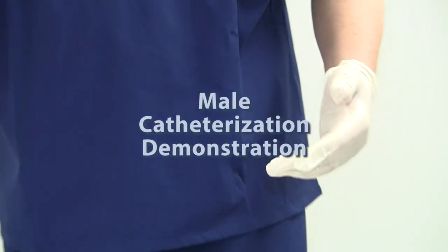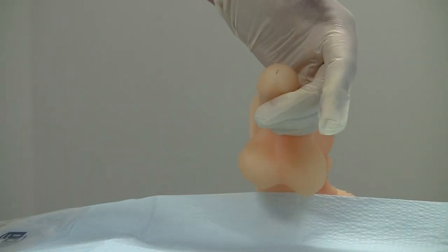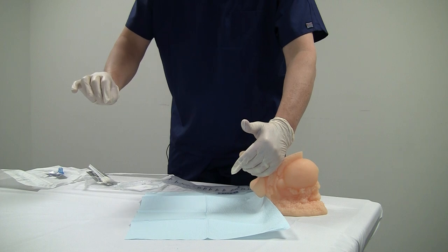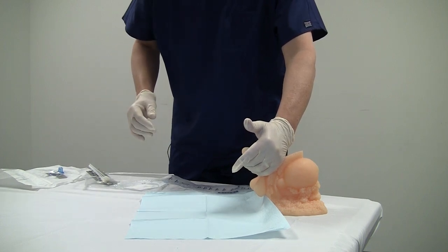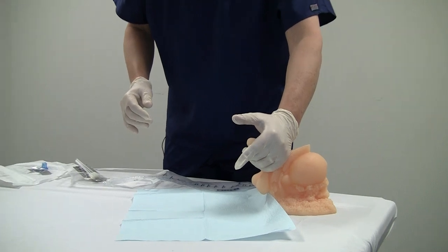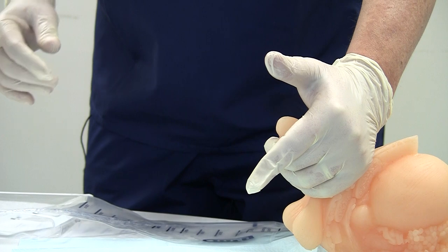So the first thing I'm going to do is pull any foreskin back with my last three fingers of my left hand. I'm right-handed, and all the advancement of the catheter will be done with my right hand. I'm going to use the left hand to stabilize the penis. And notice here that I'm freeing up my thumb and my index finger, and I'll explain what they're going to be used for in just a second.